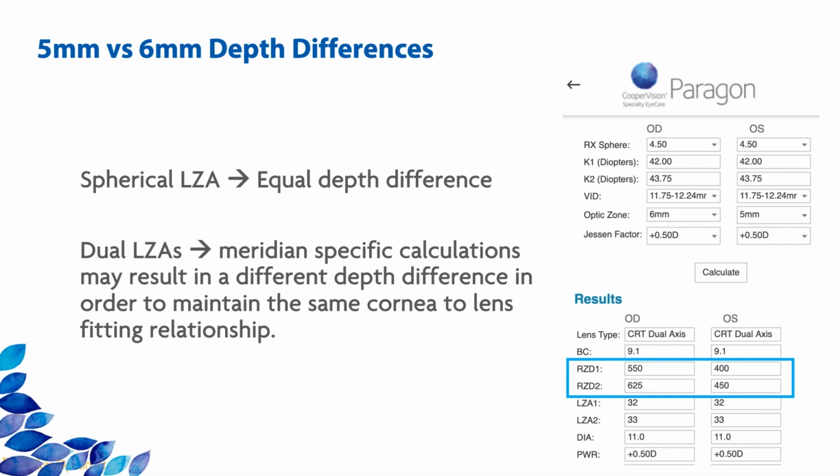With that, I want to open it up to further questions, and we do have a couple here. Dr. Liu, our first question for you actually is from the clinical study. How did you troubleshoot the lenses in the clinical study? For example, if a 5mm lens was temporarily decentered, how did you troubleshoot that, and was it different from the 6mm OZD?